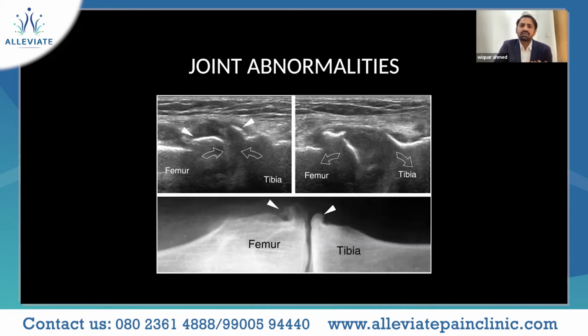So it is like how much is reflected back. Depending on that, the structure can be bright white, or black, that is your anechoic, and hypoechoic, that it can be blackish or grayish. So depending on that, we can separate it. So it's very important for us to eliminate anisotropy before we step on and give a diagnosis of a certain thing and start treating it.